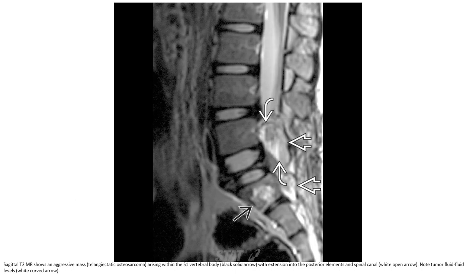This is a T2-weighted image showing an aggressive mass called telangiectatic osteosarcoma, arising within the S1 vertebral body with extension into the posterior element and spinal canal. Note the tumor fluid-fluid levels.